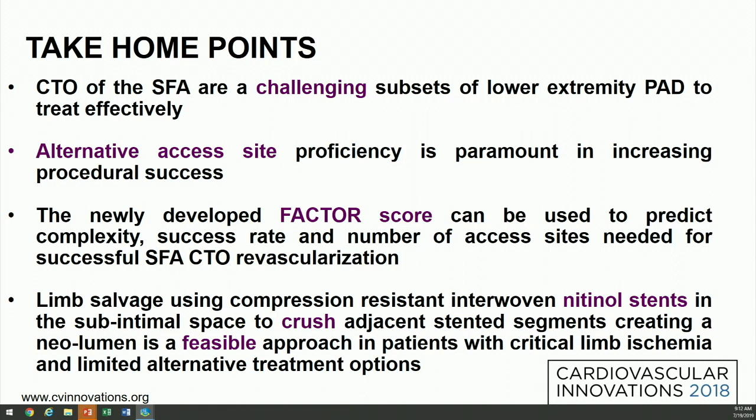Now we brought him back, as I showed, and we re-imaged at 6 months, and the stent stayed open, which was promising, and we continue to follow him up, and actually after both interventions, he's feeling great now. So for what it's worth, it worked for him, maybe not for everybody. That's true. All right. Well, thank you, Luai.